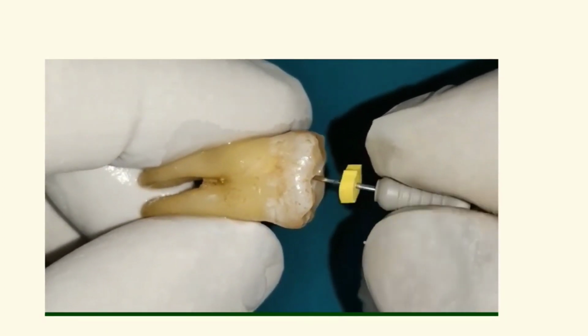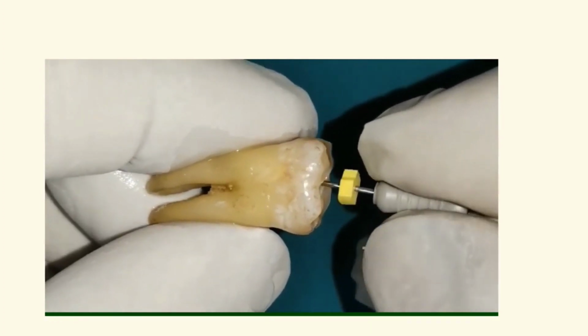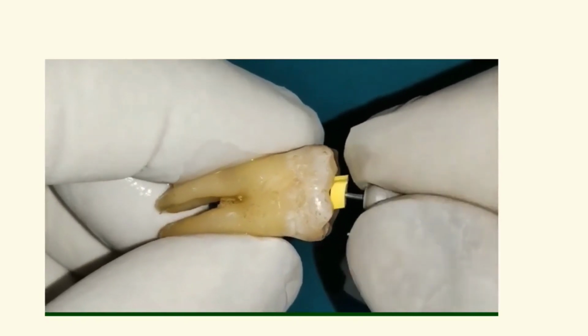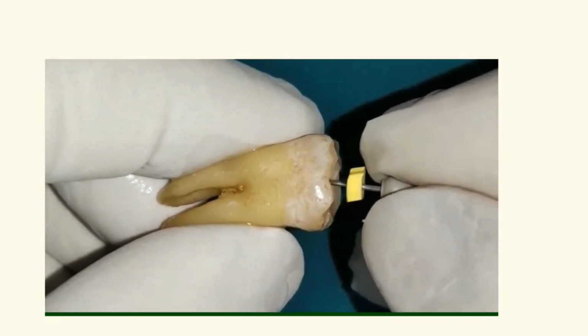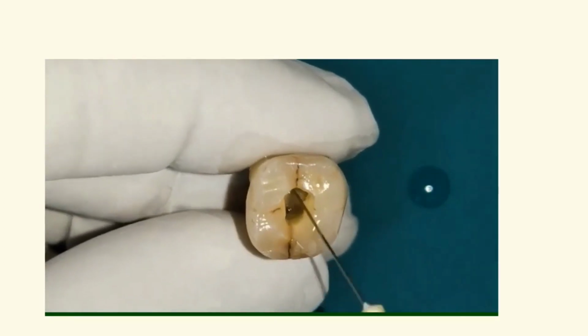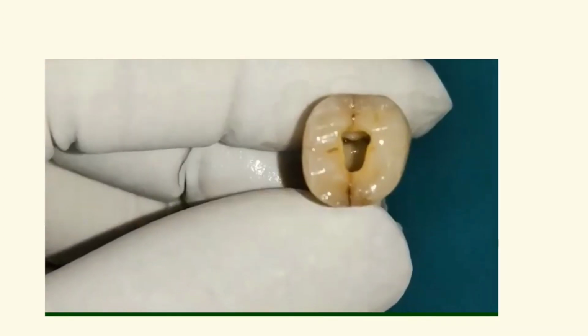Then a number 8 or number 10 K pre-curved file coated with EDTA is passively and very gently introduced into the canal without forcing or pushing it. This initial instrument requires only watch-winding motion. This is always a safer way to advance a file down into the canal. Keep an eye on the stopper to check whether the file is progressing apically.